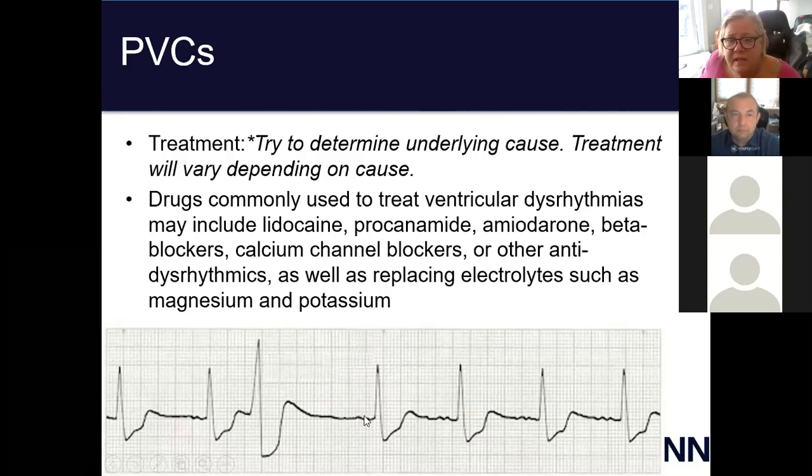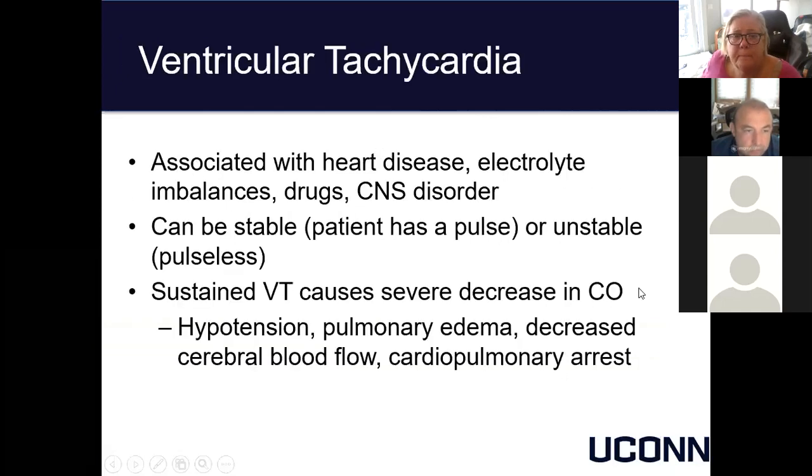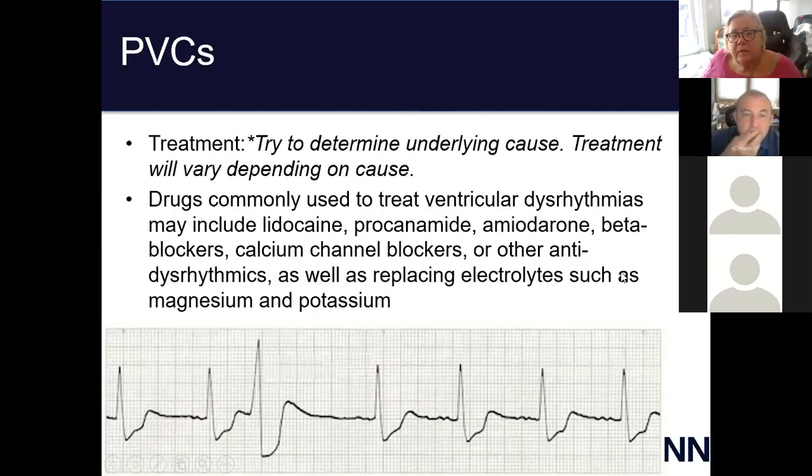What do you think, Eugene? Does that sound reasonable there? At baseline, and has an irritable focus as well. Yes, looks like that. Thank you. Does that also have ST depression? That's a great question, Jonathan. Yes, ST depression is harder to diagnose with left bundles.